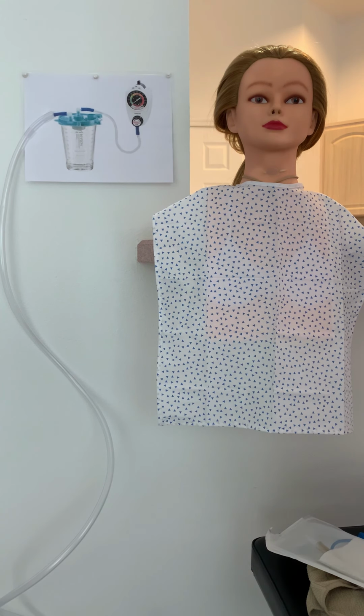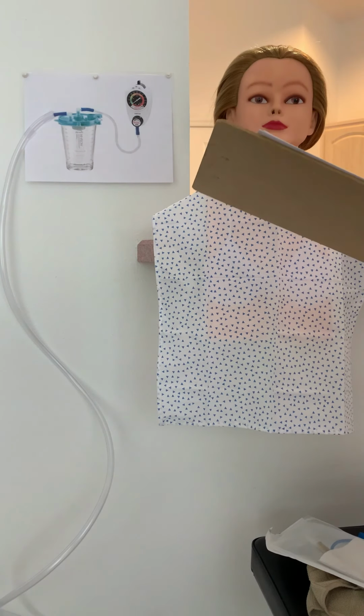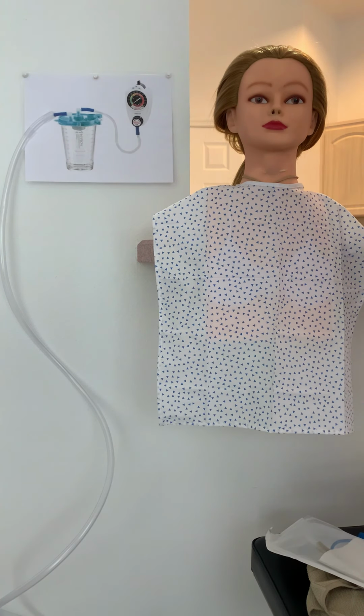And we'll hook that up to suction on the wall, and that will help suck out the content in your stomach that's not able to pass. This should help a whole lot with your nausea and vomiting, and it'll also help with that pain you've been having. Can you just verify that I have the correct patient? Can you tell me your first and last name and date of birth? And I will verify that against the medical record, and it matches.